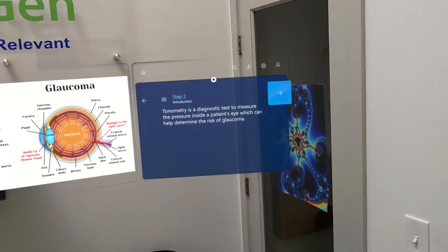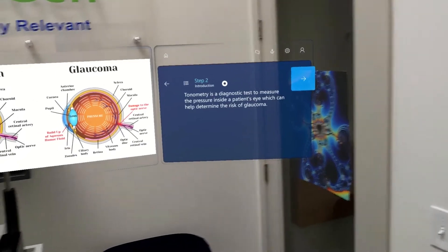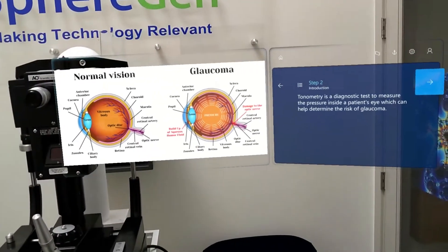Step two. Tonometry is a diagnostic test to measure the pressure inside of a patient's eye, which can help determine the risk of glaucoma. There is some visual information here comparing normal vision and glaucoma.